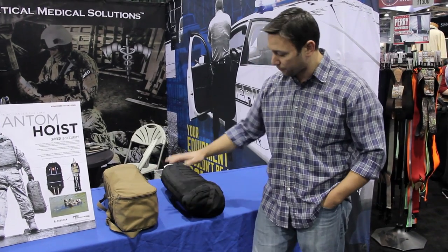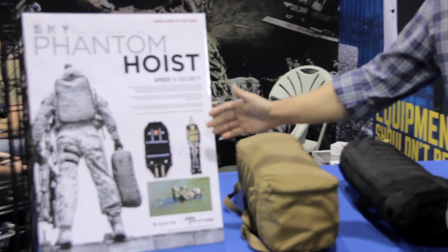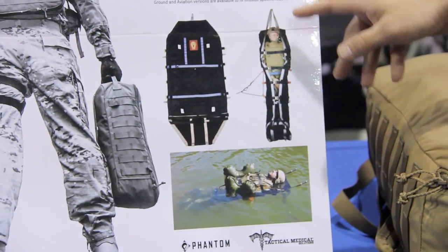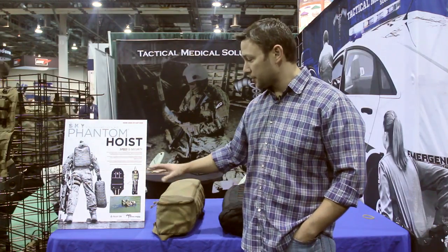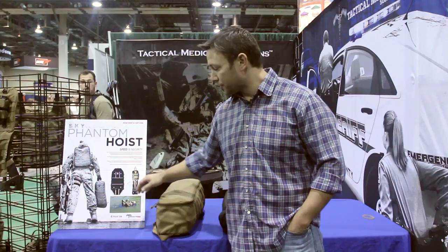You can see the size of the system in its stowed ground version relative to your average Foxtrot litter. What we have here is a pre-rigged casualty system, pre-rigged to go either horizontal or vertical with the casualty. There's no external rigging needed, no mountaineering expertise. The system is all set to go, has airworthiness, and life-rated webbing from NFPA. It's a color-coded system — blue for the casualty, orange for the tagline, black for the system straps, and anything silver is life-rated.